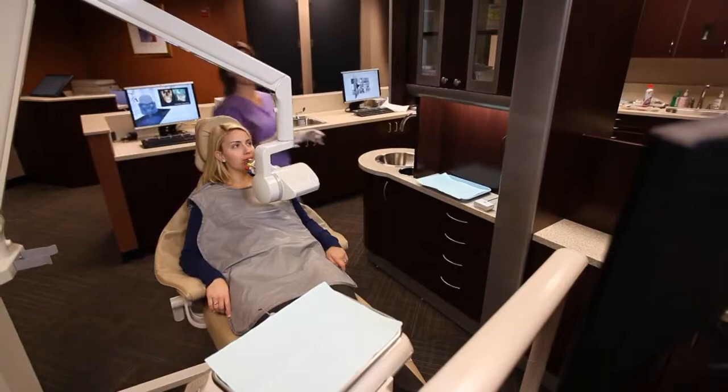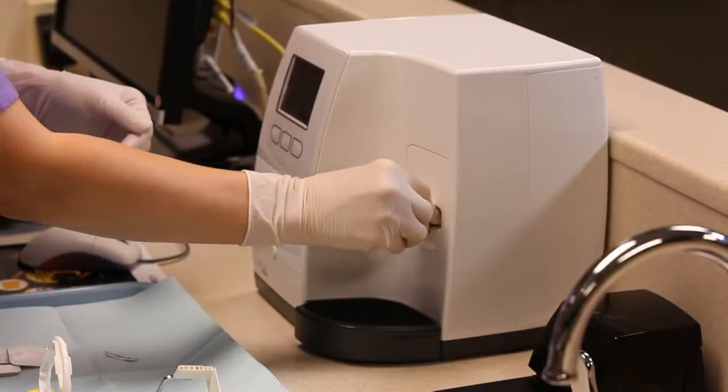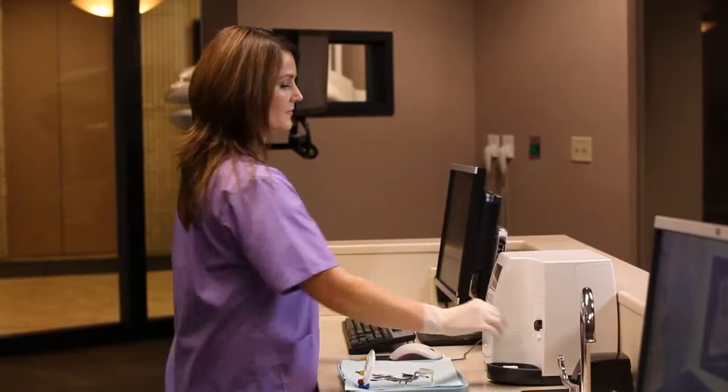The CS7600 is as easy to use as film with all the benefits of digital imaging. It provides outstanding image quality up to 17 line pairs per millimeter, with a first image viewed in as little as 5 seconds and a full mouth series scanned and displayed in minutes.